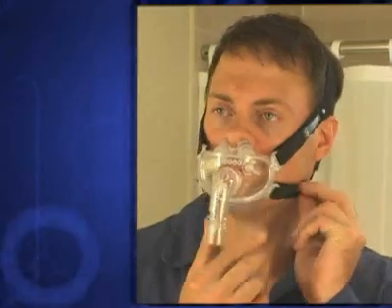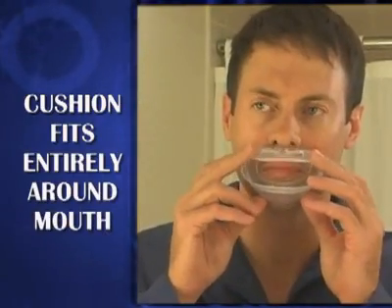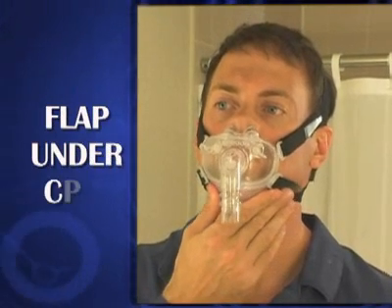Note that each strap should be adjusted to achieve an overall even and balanced pressure between the cushion and the face. Remember that the oral cushion should fit entirely around the mouth with the upper section completely on the upper lip and the chin flap securely under your chin.